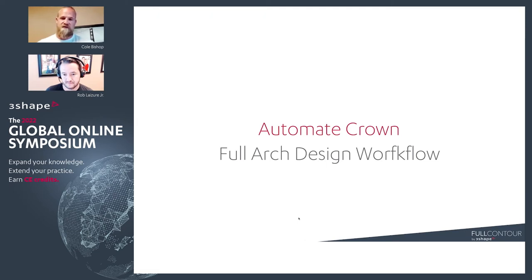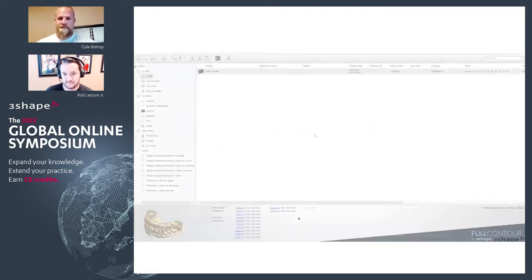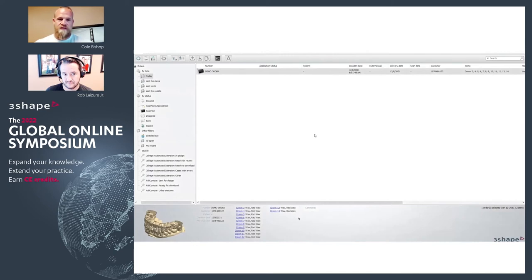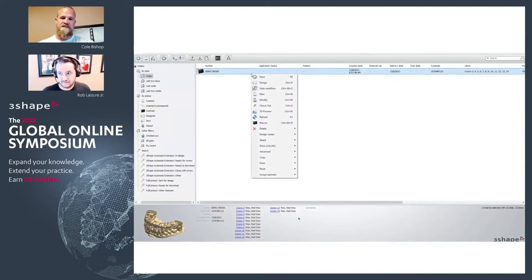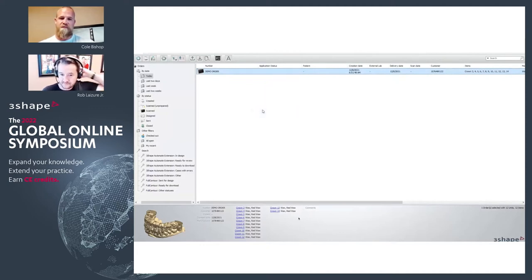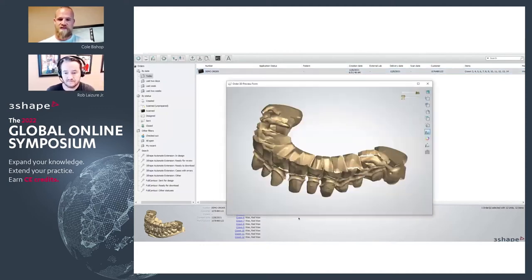I'm going to touch on the full-arch workflow here. As you can see on this demo order, we have a 12-unit single-units upper arch.